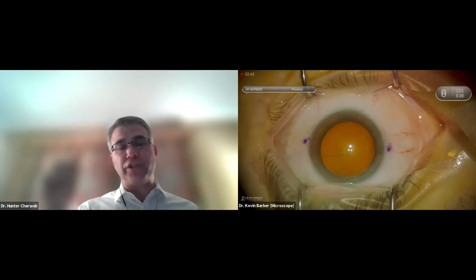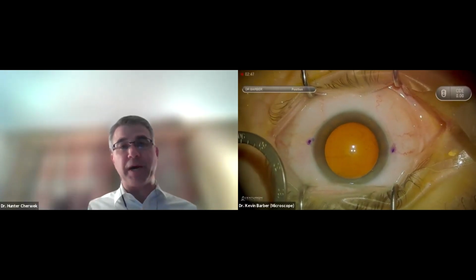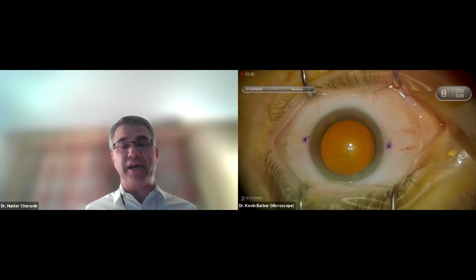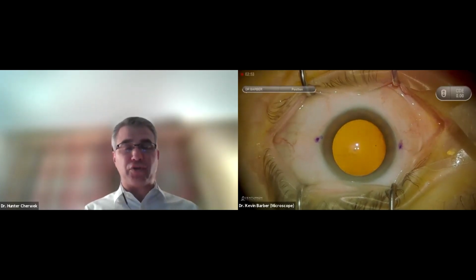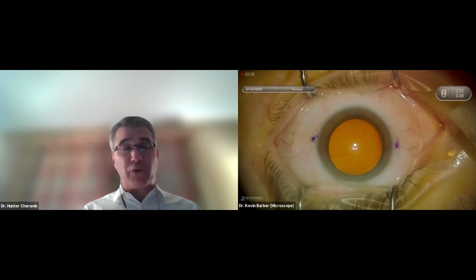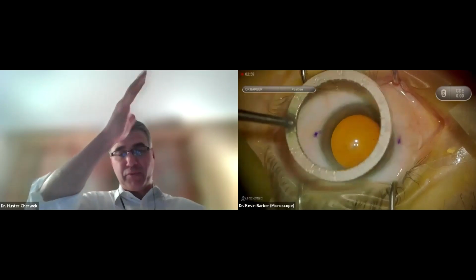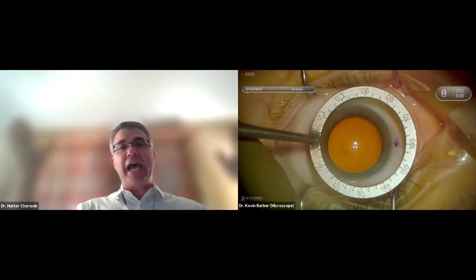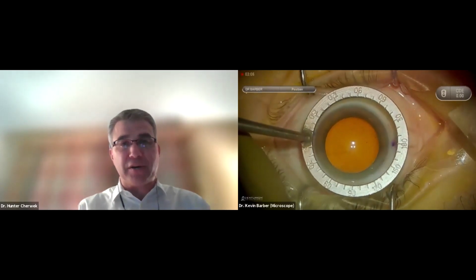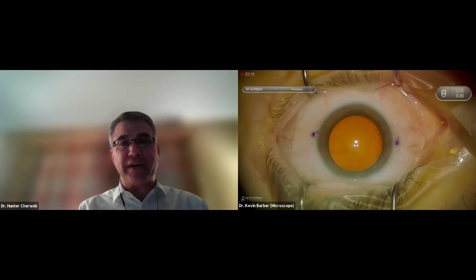The surgically induced astigmatism, SIA, is something you're going to want to customize for your hands and your practice. So as you start your journey to becoming a refractive surgeon, I strongly recommend that you keep an outcomes log so that you can compare each patient: what was the pre-op and the post-op refraction, what was the expected refraction, and look to refine any of the variables that can help give your patients the best possible refractive outcome.